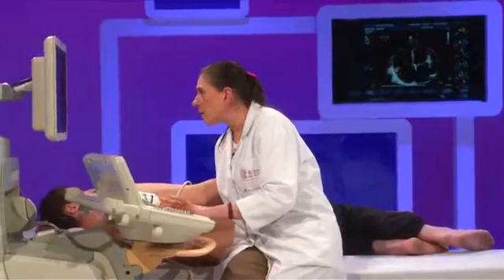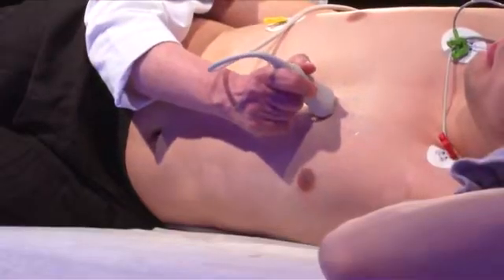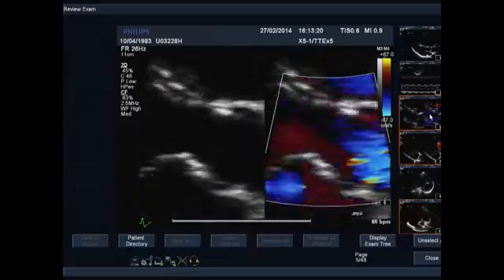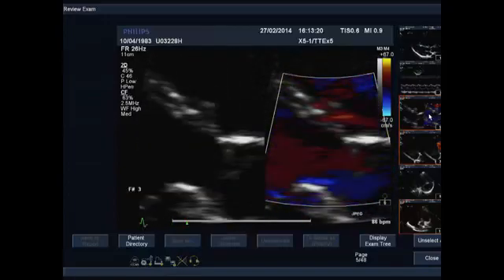through the pulmonary valve. So let's start doing that, and I will start by going back to the parasternal short axis view, and at this view I can freeze and take the measurement here of my left ventricular outflow tract. This is the first measurement that I need to make a shunt report measurement.